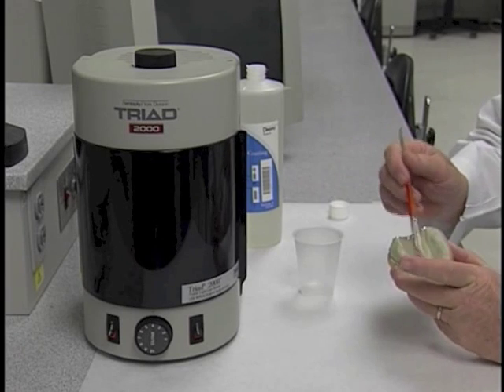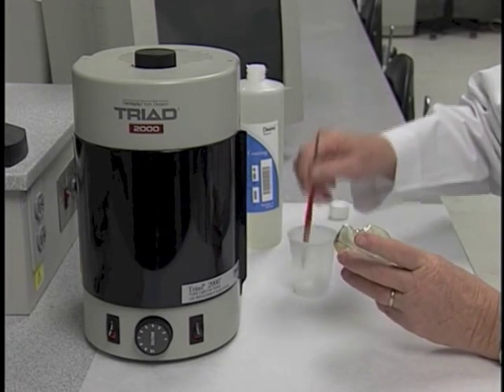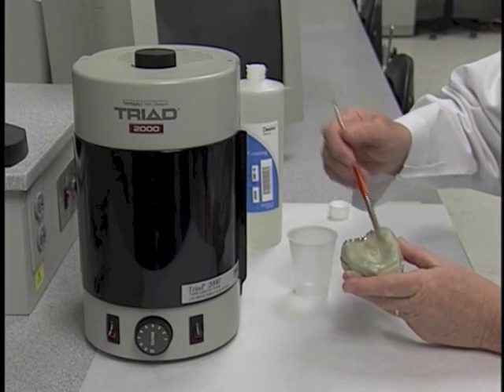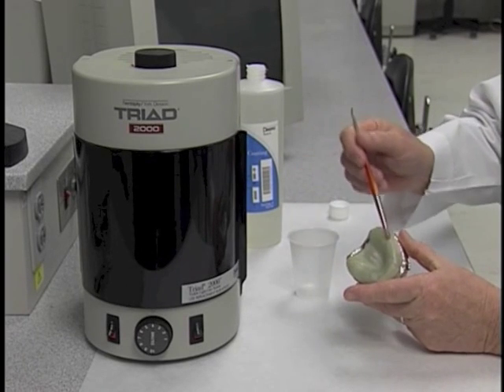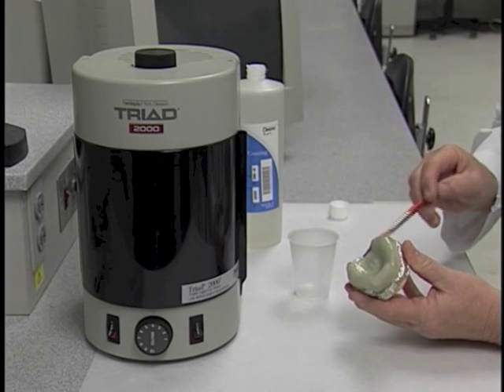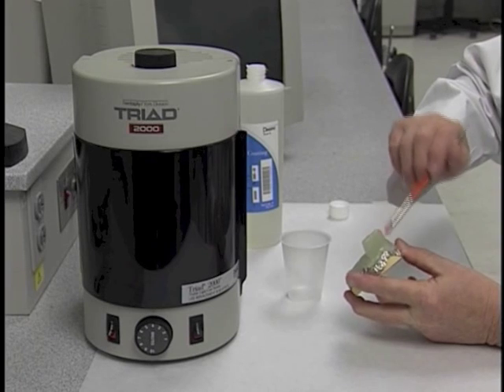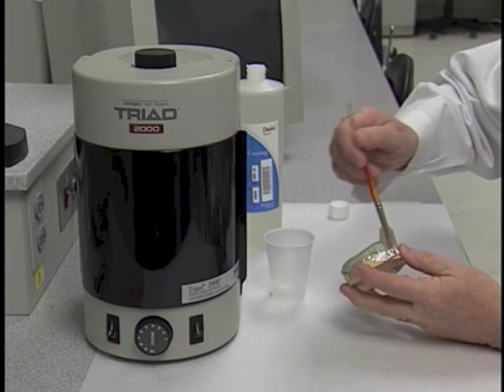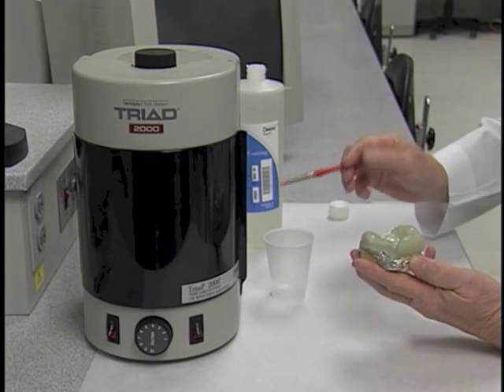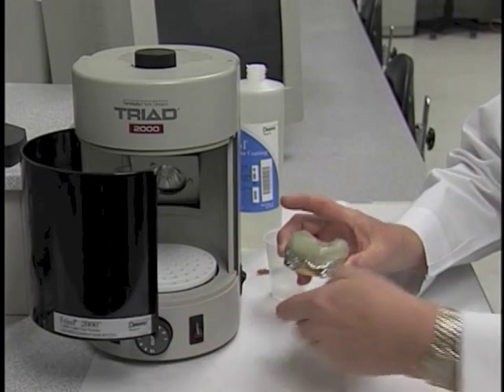A brush, and put a gentle light coating of the air barrier material on the external surfaces of our tray. And once we have it painted with the air barrier material, we place it into the oven.